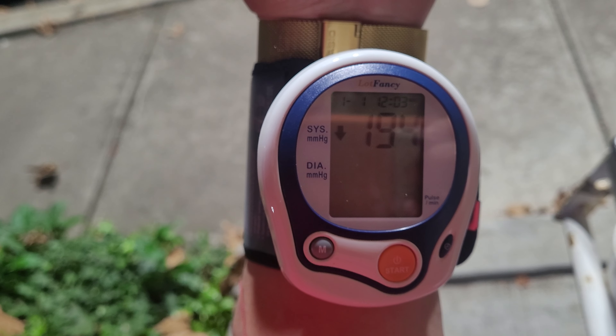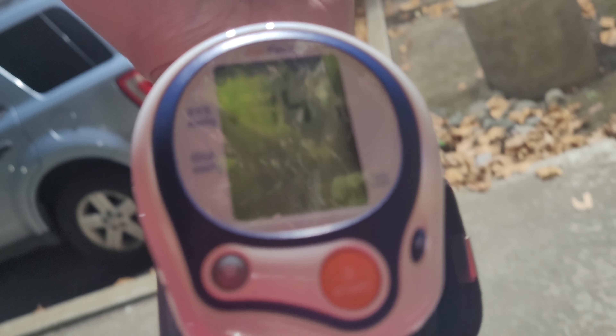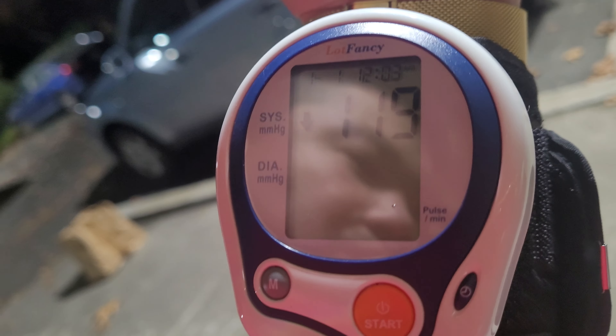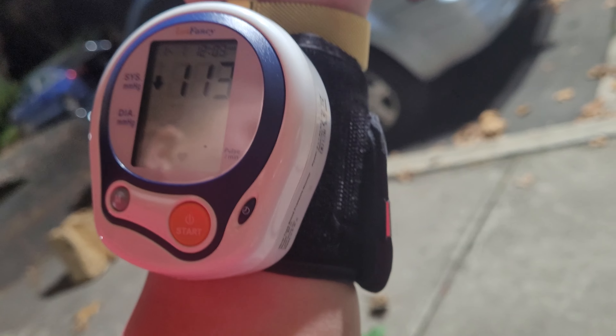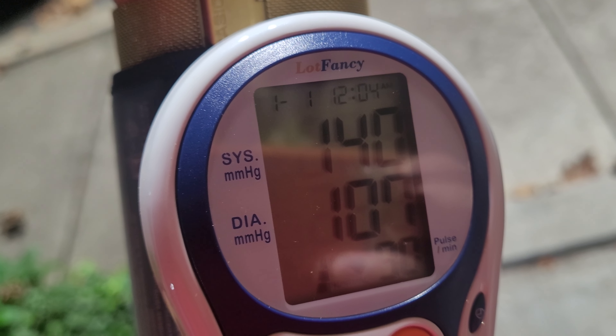Blood pressure again — we'll see what happens. While we're waiting, it has a nice looking shape. It has a time on it — 140 over 107. I have to say I had a big meal; I don't know if that's the cause of it. But the point is, it is what it is. For the price, I think it's pretty good.